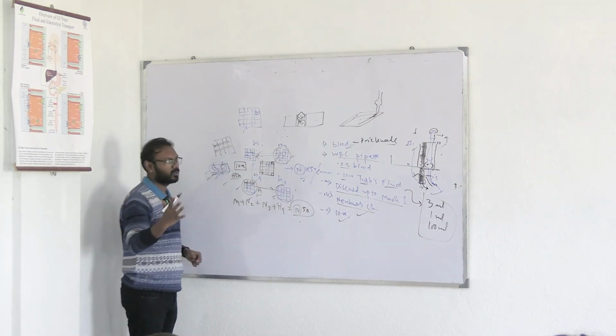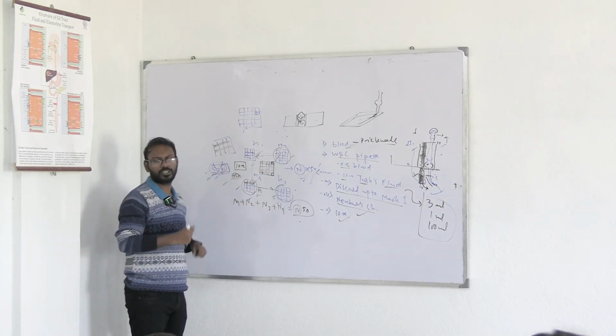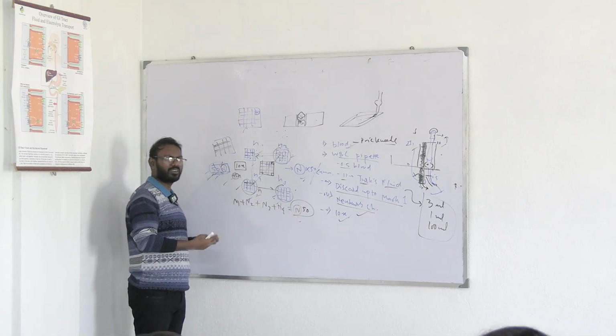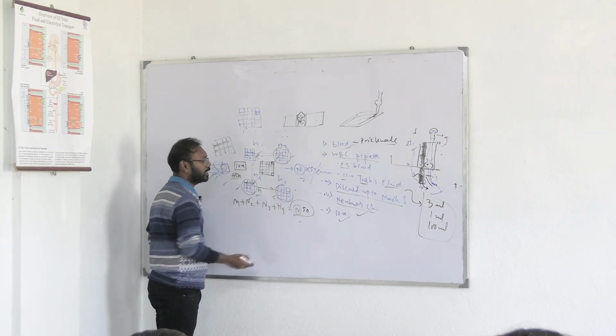I will explain these next day. For now this lab work will take more time, so we won't waste time here; we'll focus on the procedure first so that everyone is comfortable with maintaining the process. So we will multiply by 50, that will be your value.